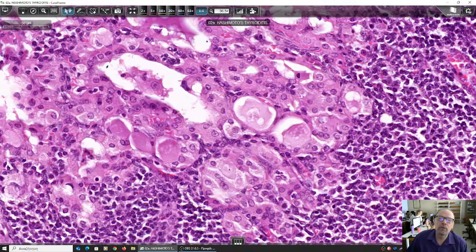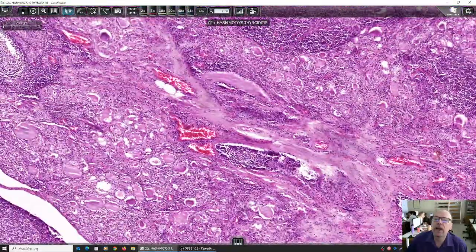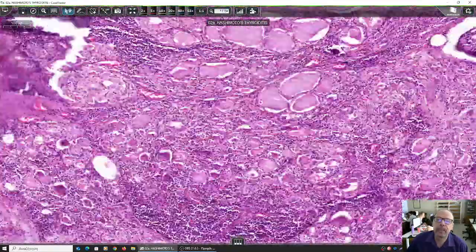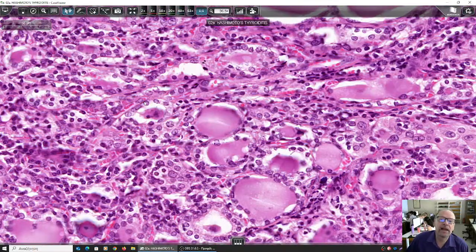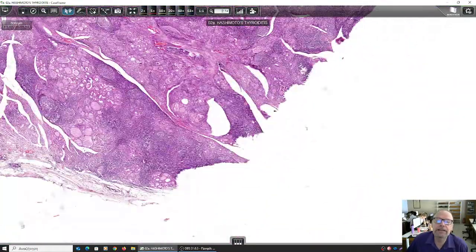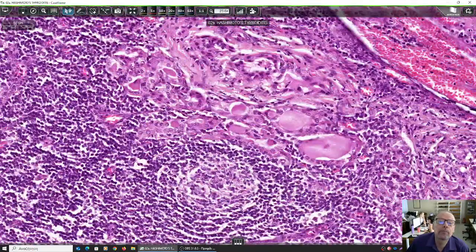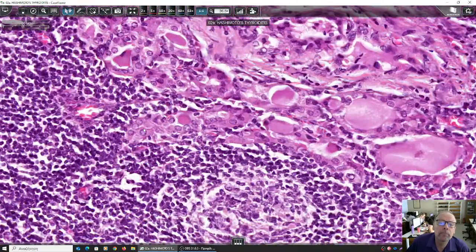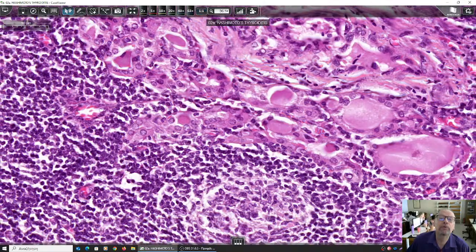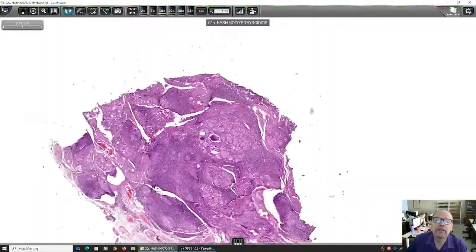What are these cells now? What's the difference between these cells and the ones I previously showed you? Again, let's try again. Have a look at these cells, normal looking, and have a look at this one. You see? This one. Let me find them in another place.